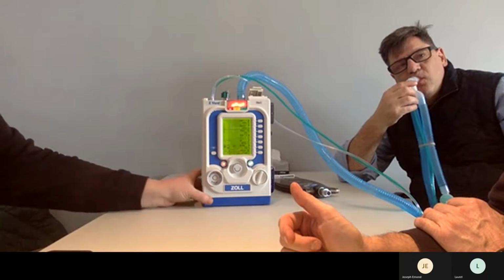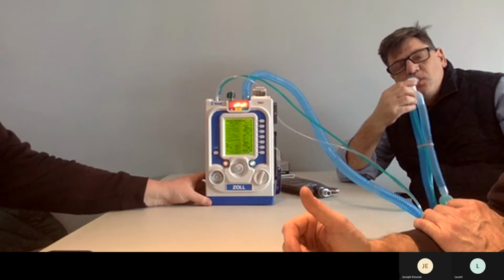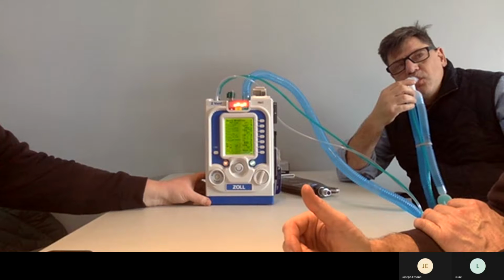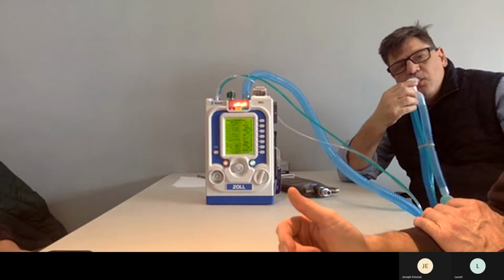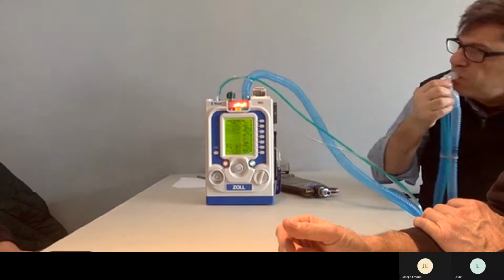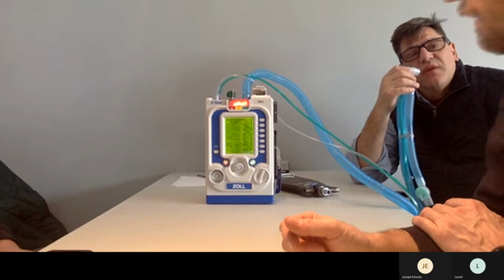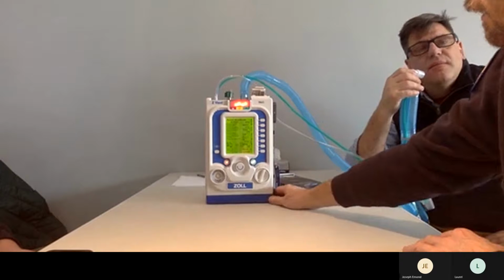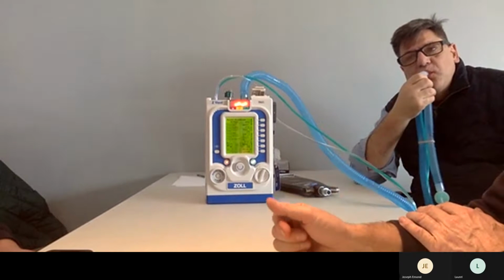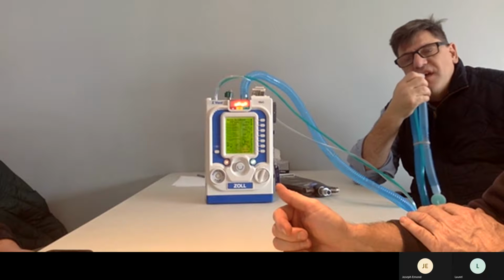Okay. 472, 596. It's all over. You're breathing 14, 16 times a minute. Your PIP is low. We're getting a low PIP alarm. PEEP is low, and there's a high breath rate. Then look next to tidal volume. Can you see those alarms? Yeah. Tidal volume is 689, but 675 with a low of 225.